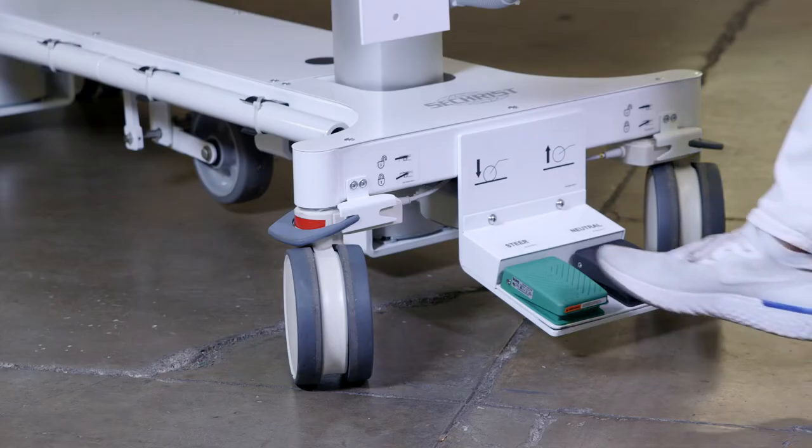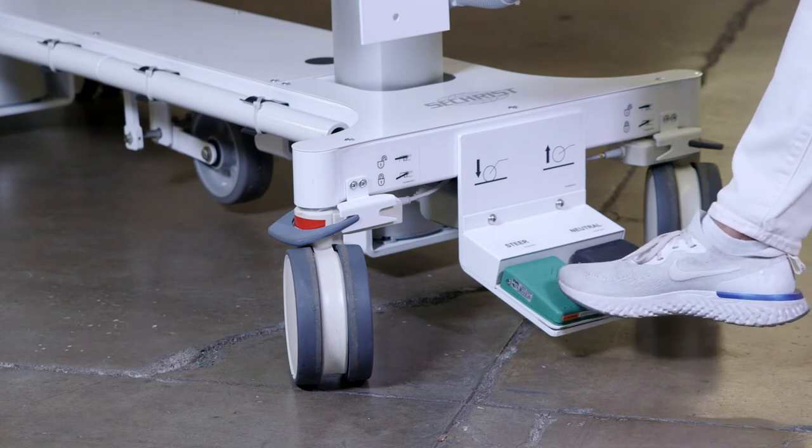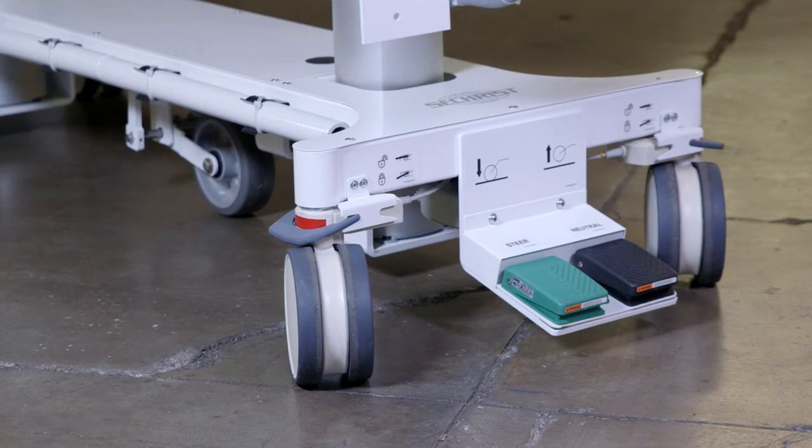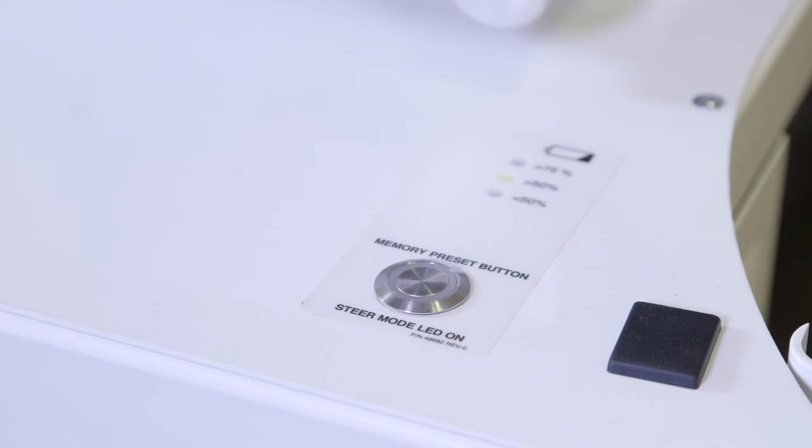Your Seacrest eGurney wheeled stretcher is also a transport gurney, so if there's ever a need to go get a patient on another floor, you can easily steer and navigate your eGurney when it is in steer mode. To activate your steer mode, gently press the green steer button. While the fifth wheel is lowering to the ground, your green light will appear — it might take a few seconds for that light to appear, so just be patient.